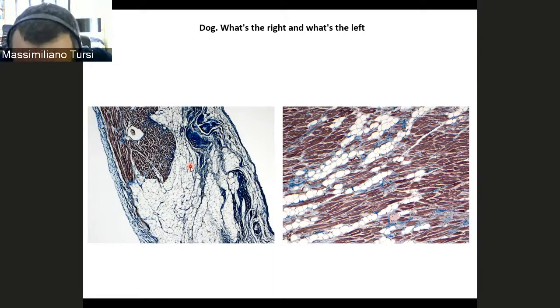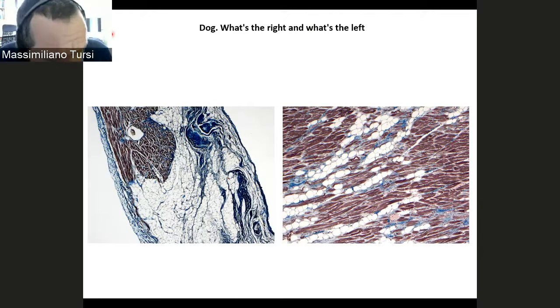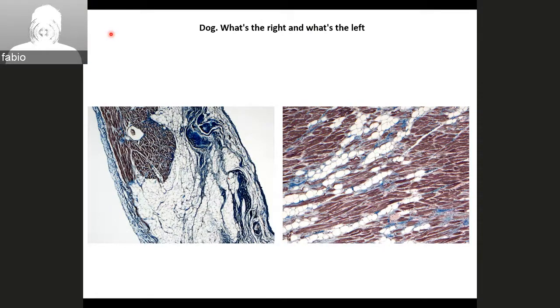But in my experience, if I see wavy fiber, I don't see the fibrofatty type. I remember in Ettinger as well, they mentioned this microscopic representation of DCM with fibrofatty infiltration. I can't remember whether they said it goes together or not. Thank you.